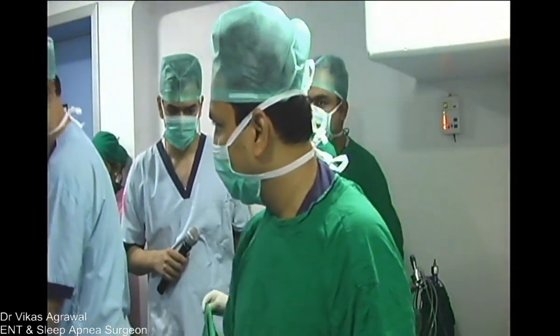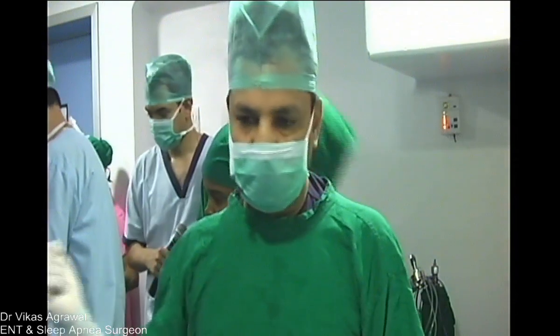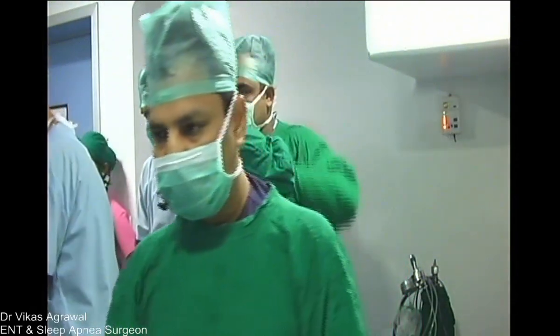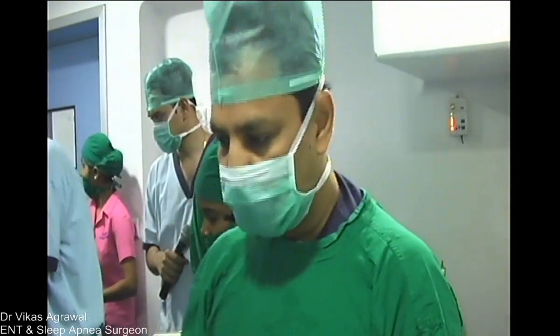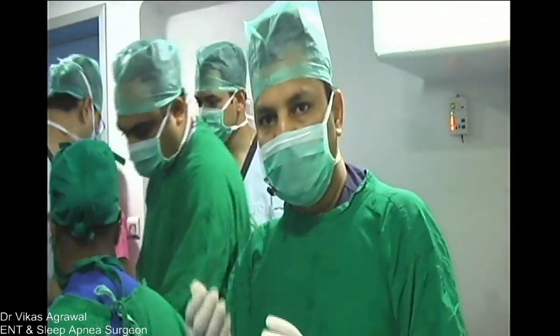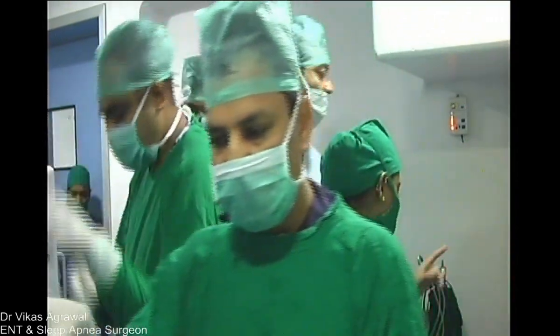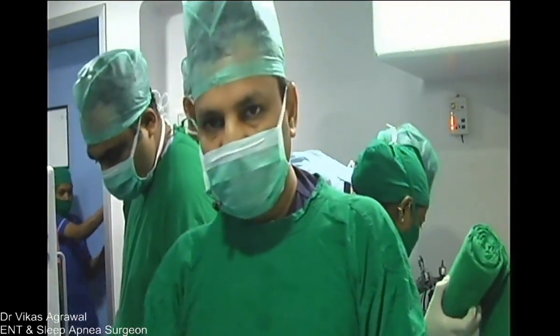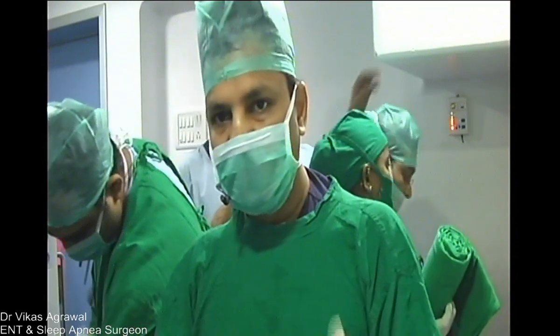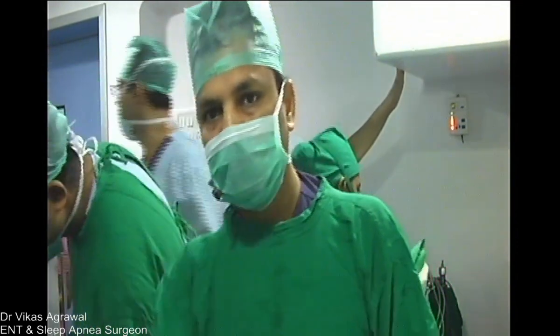Have you packed the throat? Yes. So there's a little throat pack which I have asked Dr. Kalpesh to put in. If it is a very big throat pack, then obviously it will come in our way. A small throat pack will adequately prevent any flow of fluids into the trachea. In this case, since we are going to use coblation, there will be hardly any bleeding on the soft palate. But when we are doing septoplasty, that blood is going to trickle.